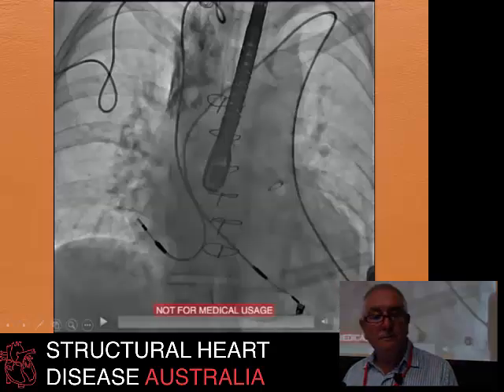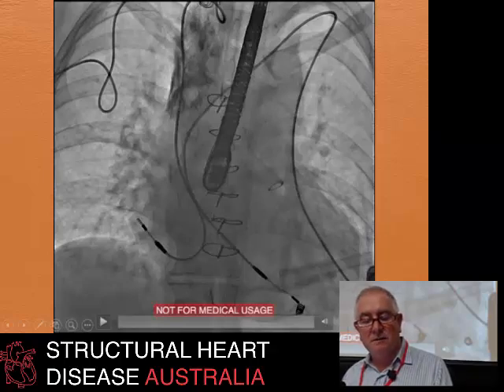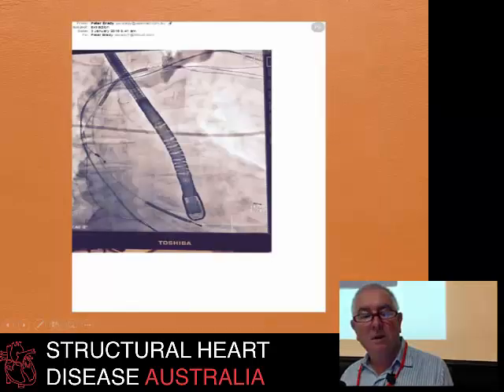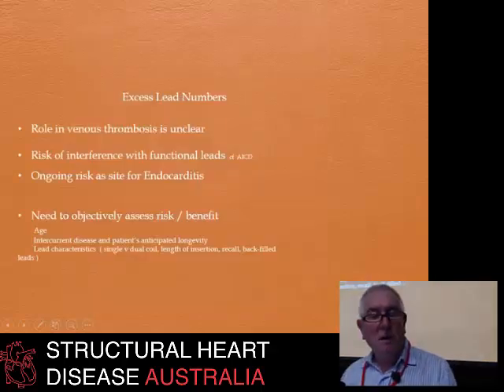This is a patient that I saw with 1 lead going down from the right side that had been abandoned, a new lead placed in from the left side that was still in position, an abandoned epicardial lead, and yet as you can see here from the venogram, thrombosis of the top part of the superior vena cava. This is another patient who's got a whole host of defib leads and abandoned leads in, and a venogram taken from the left arm with the dye not going beyond the junction of the SVC and the innominate vein.